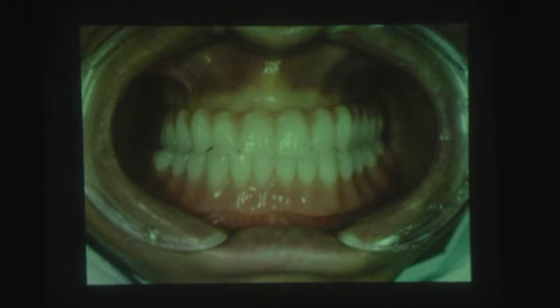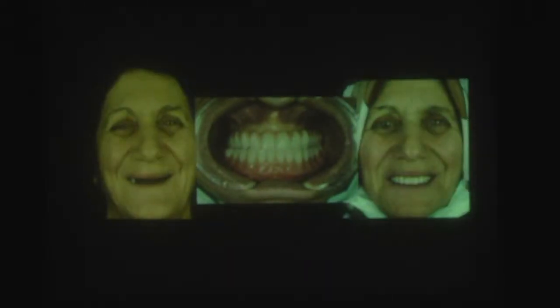Why? Because we have a very big soft tissue deficit, and hard tissue and soft tissue. It's almost impossible for us to compensate for the missing parts with porcelain crowns. So here, since we place only 4 implants per jaw, and since we have a very big deficit of hard and soft tissue, we have to finalize it with an acrylic denture. Yes, the case is finished in this way.